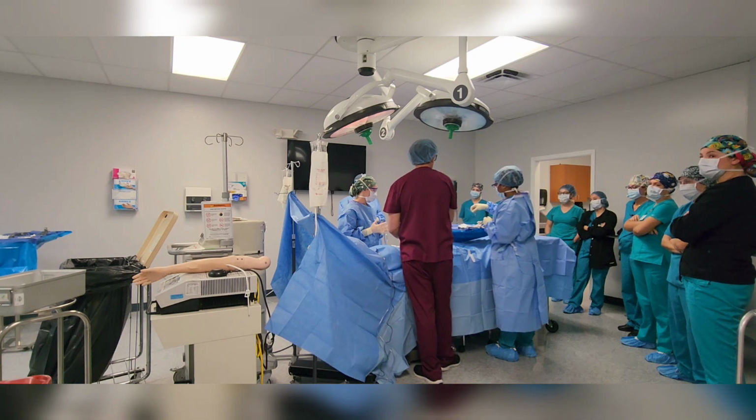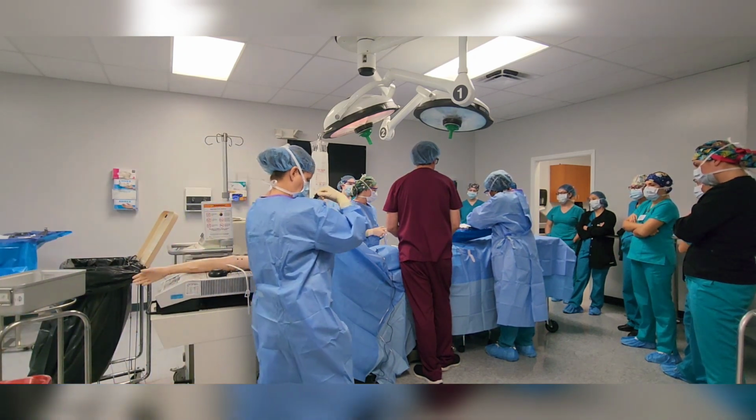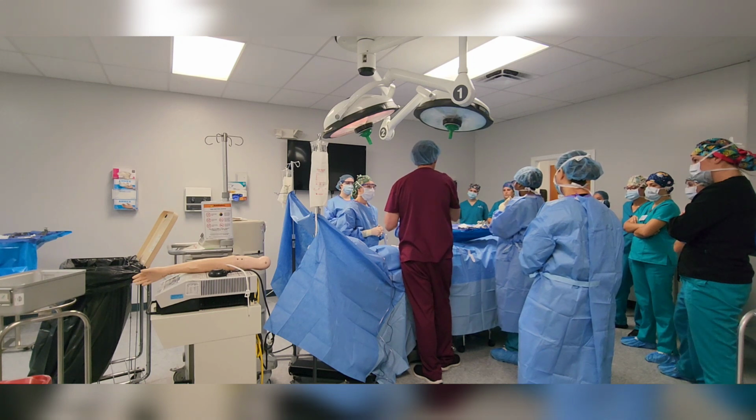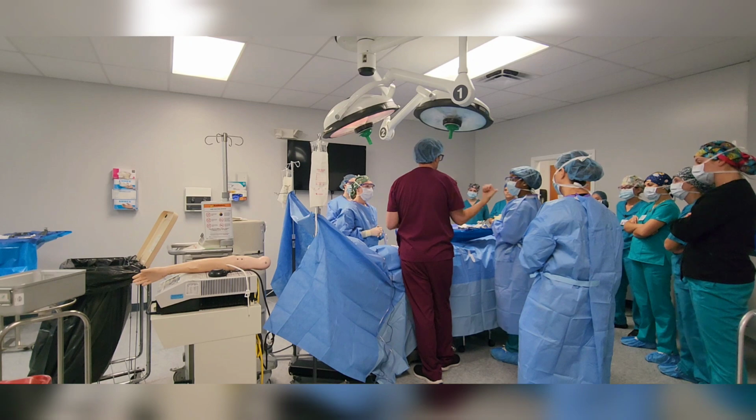Again, those blades, can we put them down by the sharps? I just don't want anyone to get stabbed. Rule of thumb is if you do an incision and we're past that, get it off your mayo. Because as soon as you have your hand on the mayo, for some reason you look up and there's 11 blades just sticking out of your hand, your day's over and you got to do a drug test.